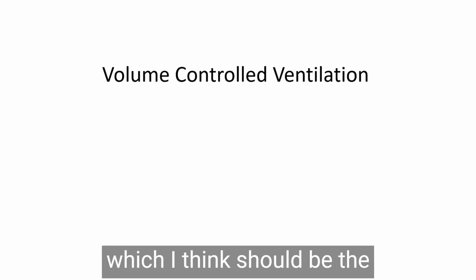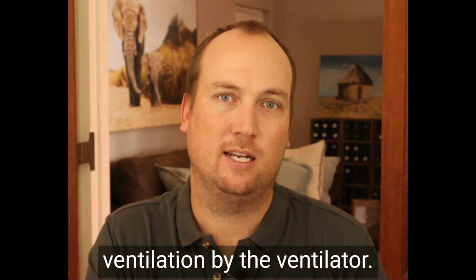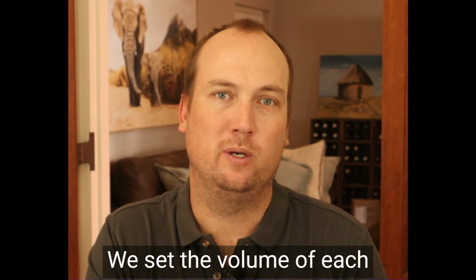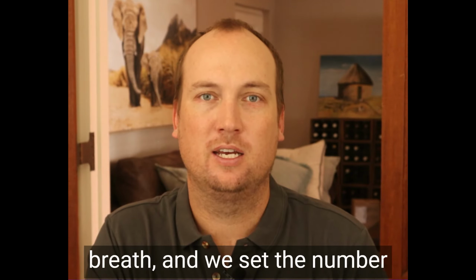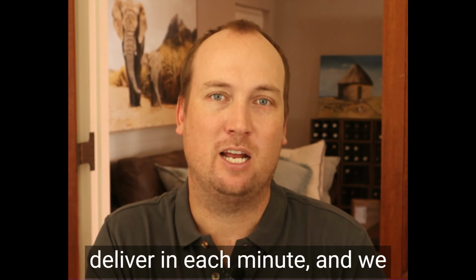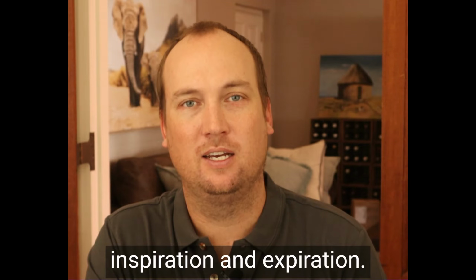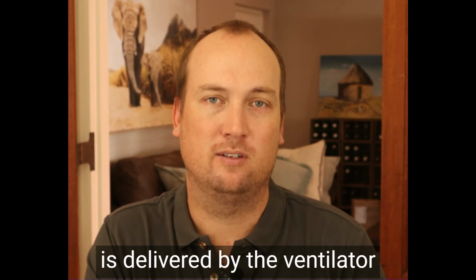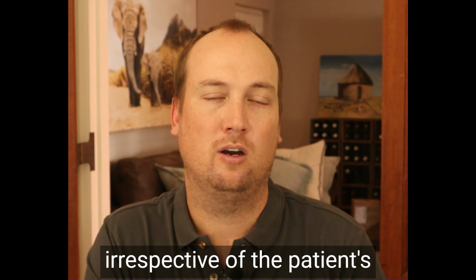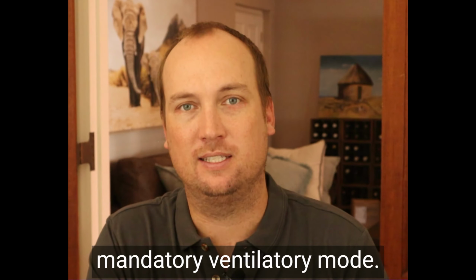Let's begin with volume-controlled ventilation, which I think should be the default ventilatory mode for the learning anaesthetist. This is a form of mandatory ventilation by the ventilator. We set the volume of each breath, and we set the number of breaths that we are going to deliver in each minute, and we can set the cycling time between inspiration and expiration. And then each of these breaths is delivered by the ventilator, irrespective of the patient's spontaneous breathing efforts. That's why we call it a mandatory ventilatory mode.